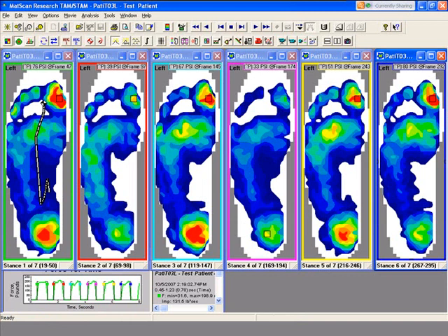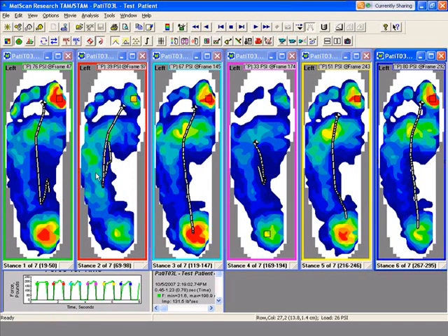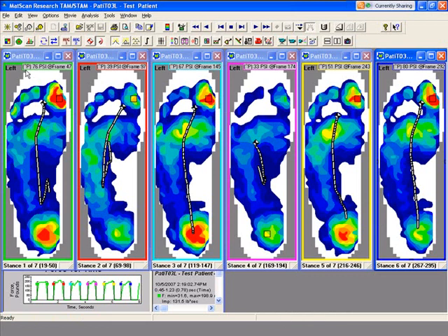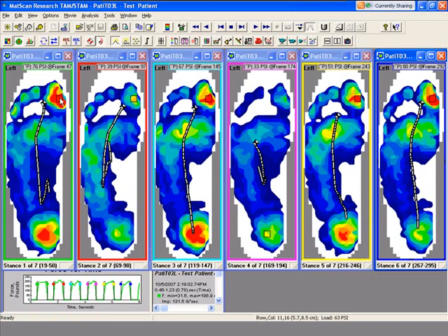What you look for here is similarities in the center of force trajectory lines. You look for the location of the peak pressures represented by this black box—are they all in the same location or in different locations? What it shows you in the panes box is what that peak pressure is. Right now over the hallux, 76 psi, and that's the peak pressure.